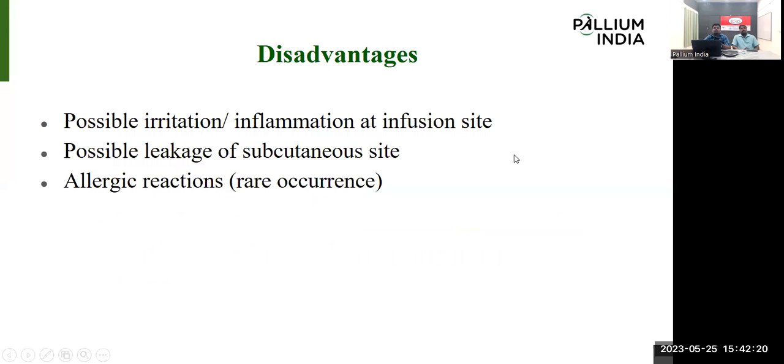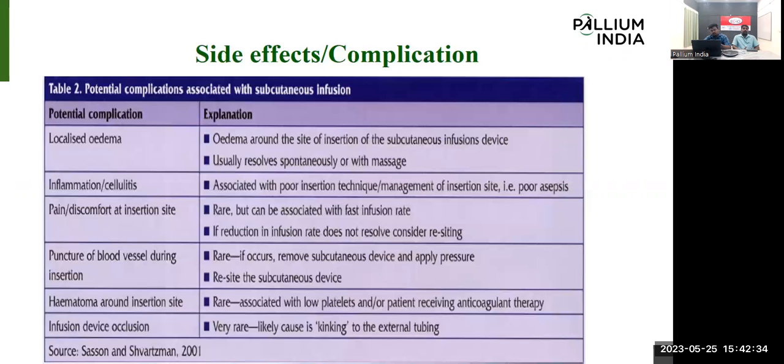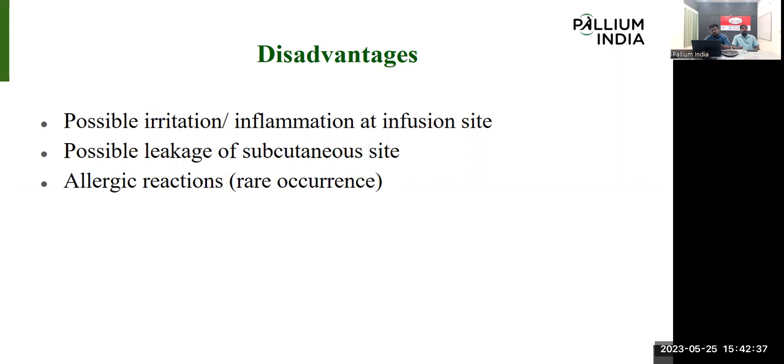Next. So as there are advantages, some disadvantages are also there. Already I told there is no inflammation or irritation chance. But in some cases, if we do not maintain the steps during the procedure, there is a possibility of inflammation or irritation on the infusion site. In some cases, it is happening.